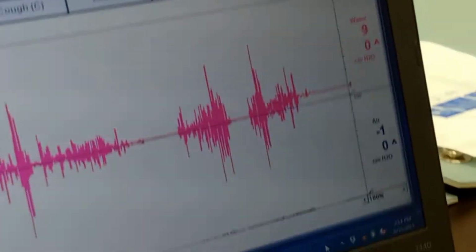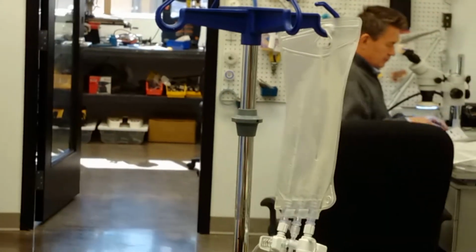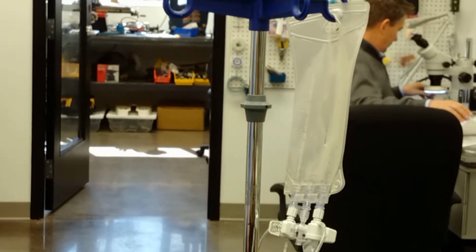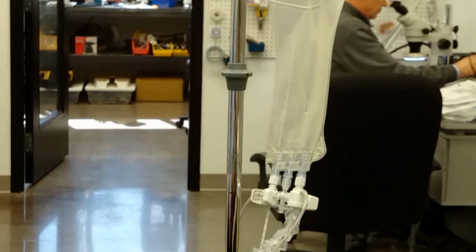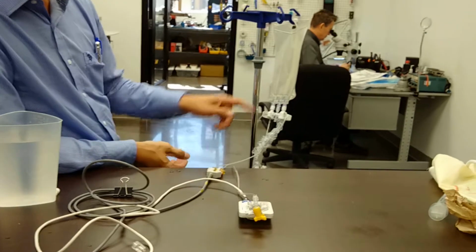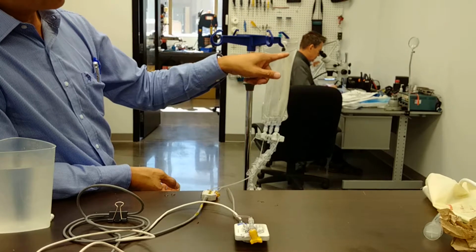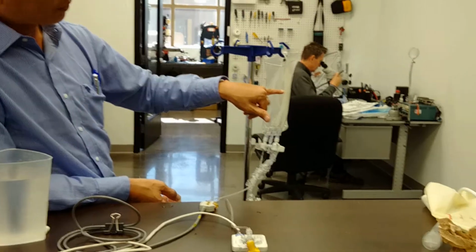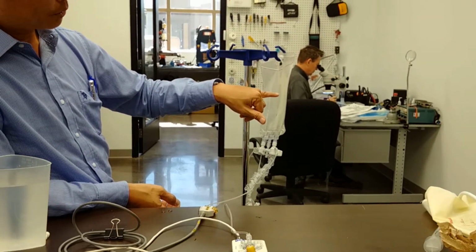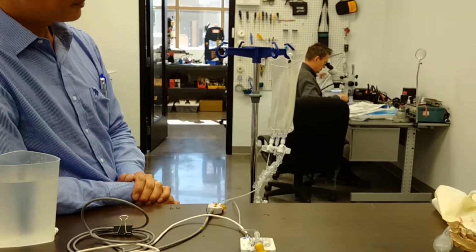Okay. So in the rectal space, the behavior is a little bit different than in a water space. Before, we were pushing the vesicle catheter, water catheter, up into the bladder, up and down, different locations, and it didn't matter. What mattered was symphysis pubis to the transducer. In a rectal space, it behaves in an opposite way. As I put this balloon, this catheter, water catheter, further up into the rectum, assuming it's upright, this relative height of the port where the water leaves the rectal balloon, or where the balloon is situated, to the height of the transducer will be raised.